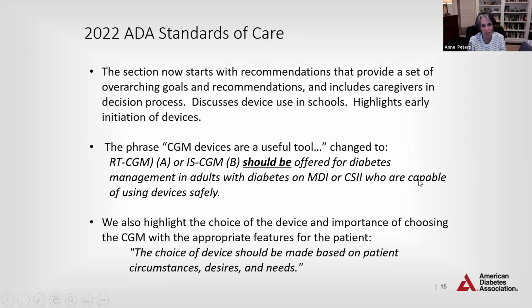We discuss device use in schools. We talk about early initiation of devices. And over again, we talk about choosing the right device for the patient. And as we talk about throughout the ADA standards of care, it's all about individualizing care.